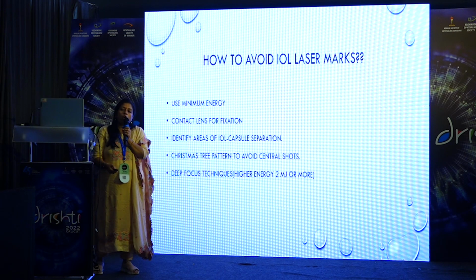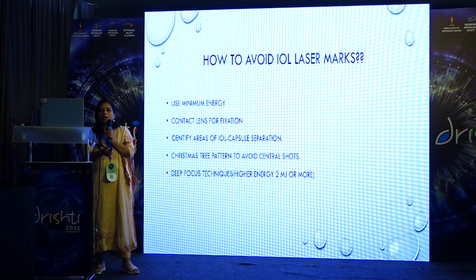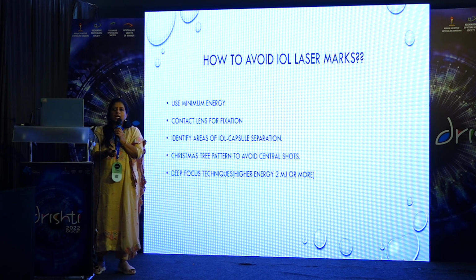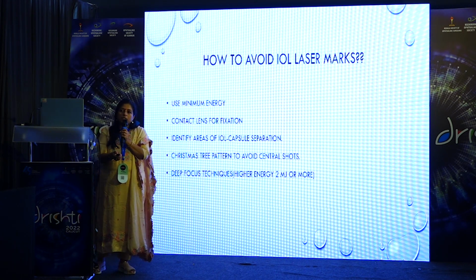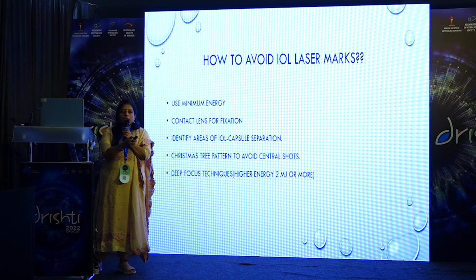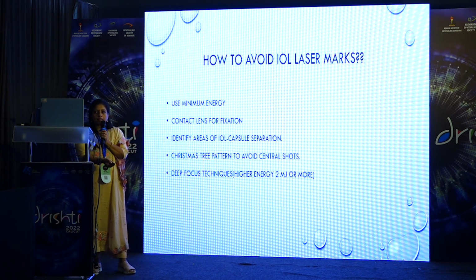How can we avoid pitting or marks on the IOL? By using minimum energy. And if the patient is not fixing properly, always use a contact lens for fixation. Identify the areas where the IOL capsule separation is there and follow a Christmas tree pattern if you feel that you are going to get IOL pitting. That is, instead of going to 3 and 9 o'clock, you go to 7:30 and 4:30 after doing the superior and inferior shots.